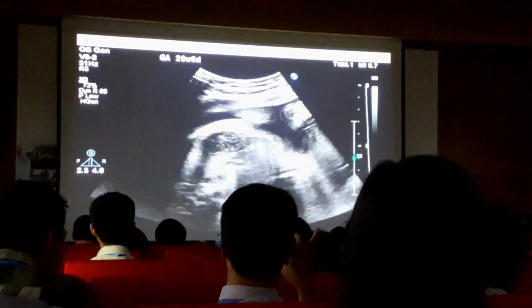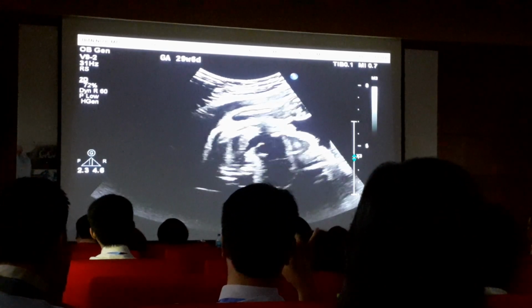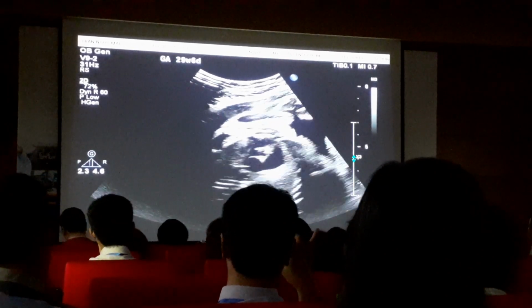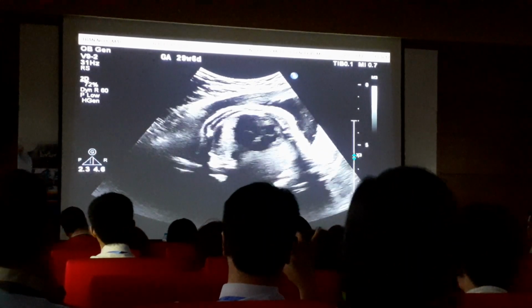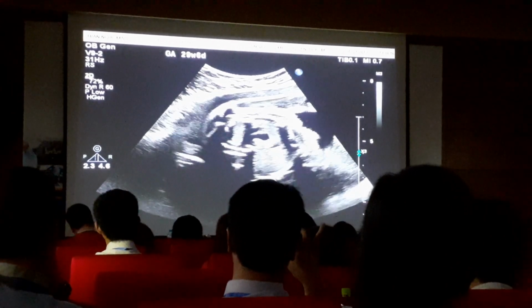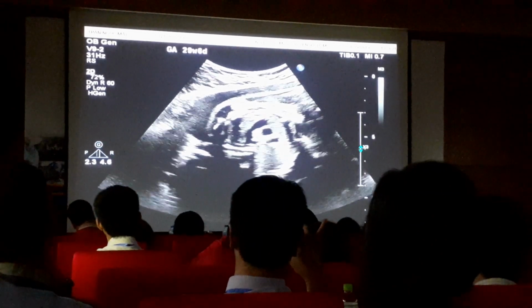So there's something wrong distal causing this elevated pressure. That can be at the pulmonary valve, so pulmonary stenosis I think about. It can be in the ductus arteriosus, ductal constriction would be on my differential. And it can be just due to elevated afterload from something like twin transfusion.